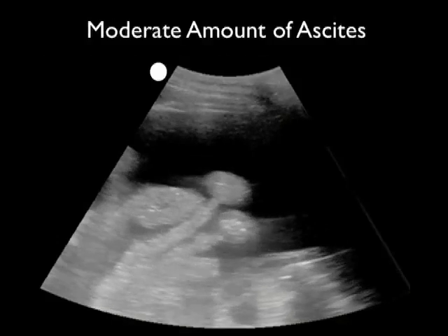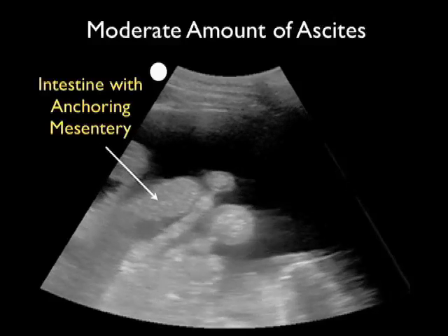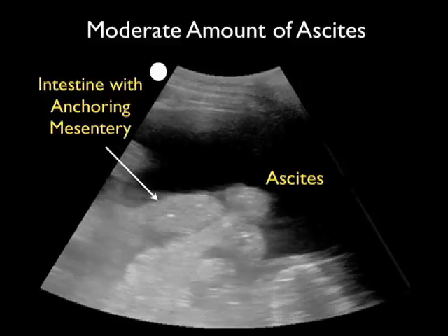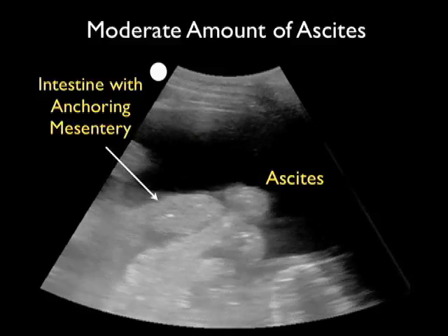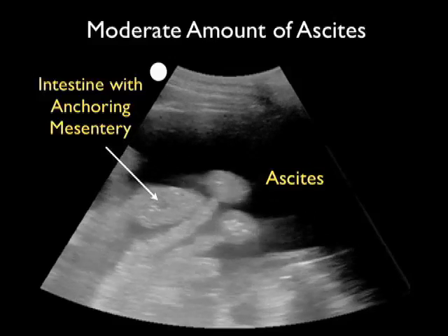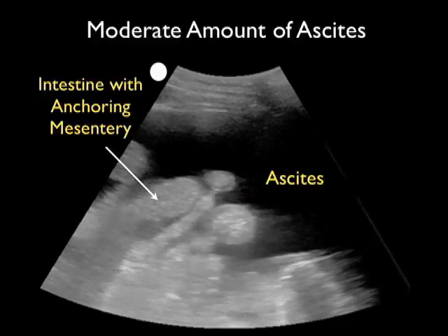This video shows a moderate amount of ascites again taken with a 3 megahertz probe. We note the intestine with anchoring mesentery sliding back and forth as the patient breathes, and we see a large collection of ascites — that dark or anechoic fluid collection — anterior to the intestine. This might be a good location to perform a paracentesis, as we could place the needle safely into that ascites without going through the intestine or anchoring mesentery.